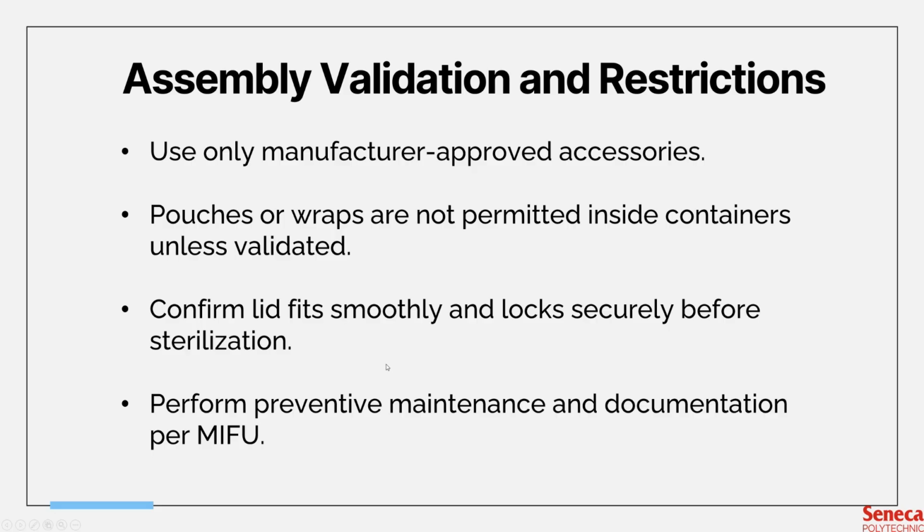If the lid or base feels uneven, that's a clear indicator that the gasket or frame may have been warped. So you should never force the lid and base together. And of course, preventive maintenance and documentation must always follow MIFU to maintain warranty and compliance. Skipping validation actually risks sterilization failure, and that directly impacts patient safety.